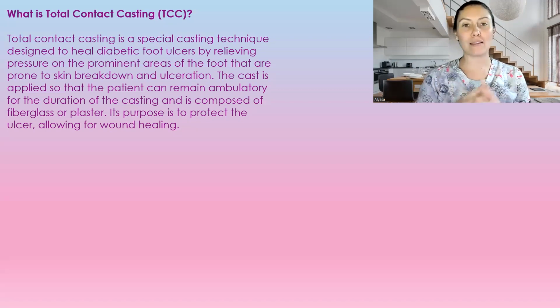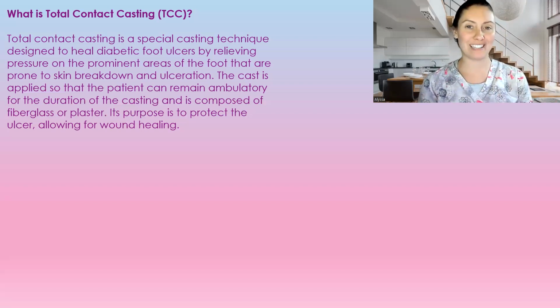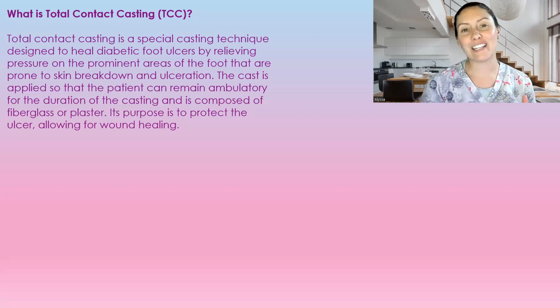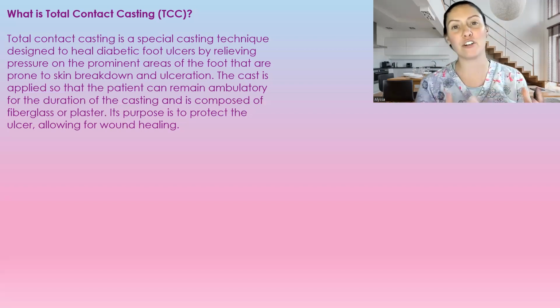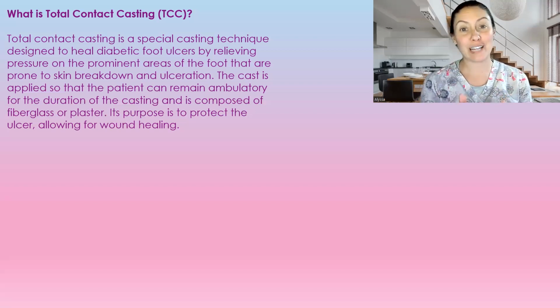The cast is applied so that the patient can still be ambulatory, so walk around for the duration of the casting, and it's composed of fiberglass or plaster. Its purpose is to protect the ulcer, allowing the wound to heal. So there's not excess pressure on it all the time, because diabetic foot ulcers are really hard to heal. A lot of times we have the ulcers because of neuropathy and not being able to feel the feet to begin with. So when a patient has the ulcer, they can't feel that it's really sore to walk on it, and they're causing more damage to it. So if we can put them in total contact casting, it allows that wound to actually heal.